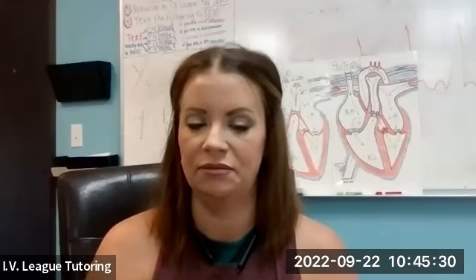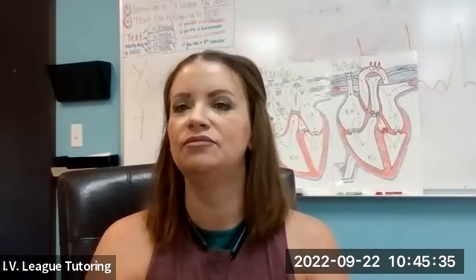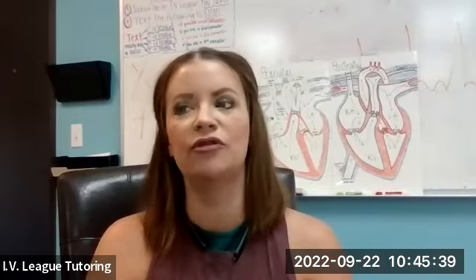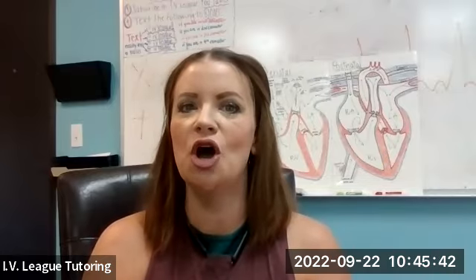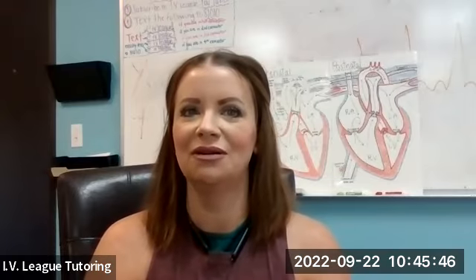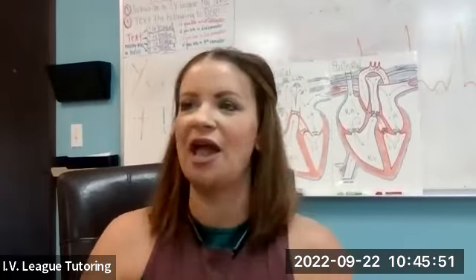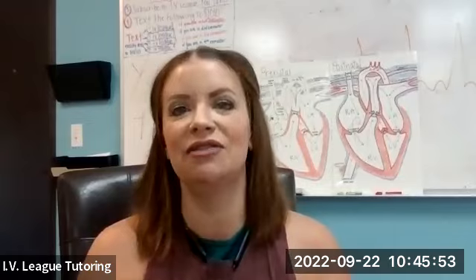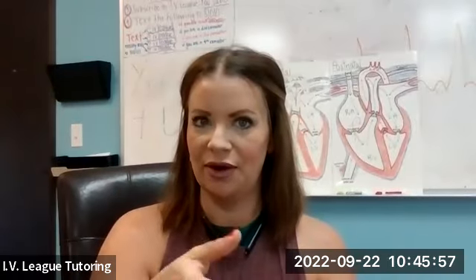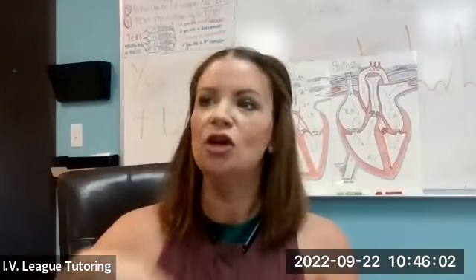What is your priority when you see someone in sinus brady? Check for pulses. Check for signs of poor perfusion. If there is no poor perfusion, we just observe. If they are symptomatic, then CPR first, because you don't have atropine just standing there, do you? So we're going to start CPR.